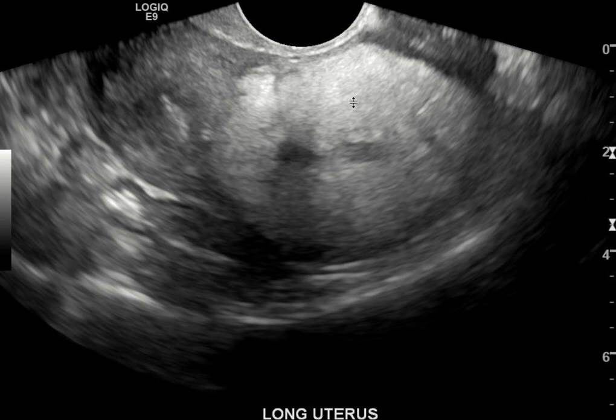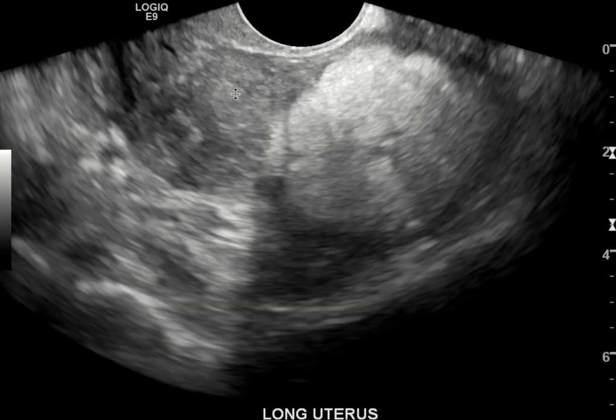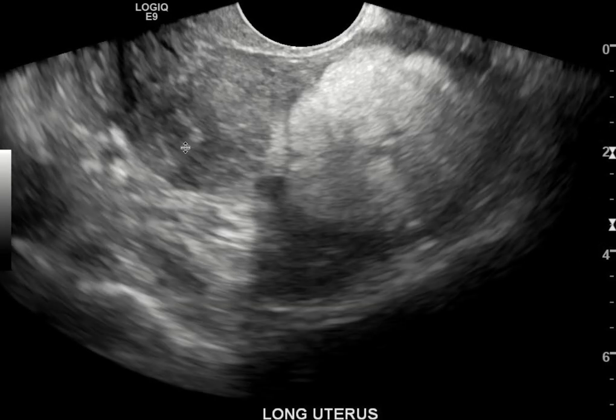Here's an ultrasound image of the uterus. We can see that this is a transvaginal ultrasound given the shape of the convexity of the ultrasound probe. And so this is a transvaginal ultrasound image of a postmenopausal patient to evaluate the uterus. And so here we can see the uterus, we can see the endometrial stripe right here.